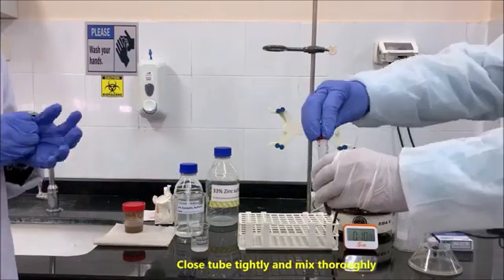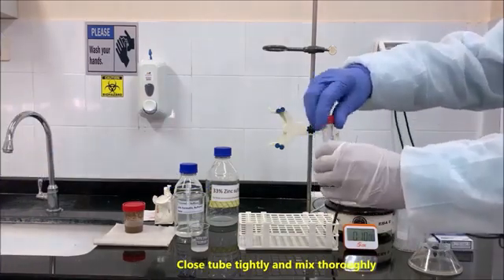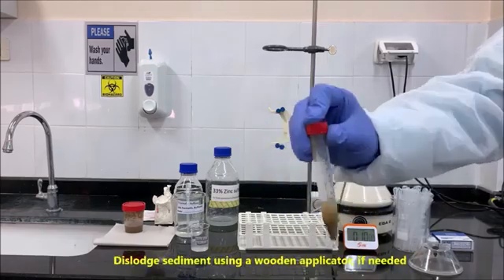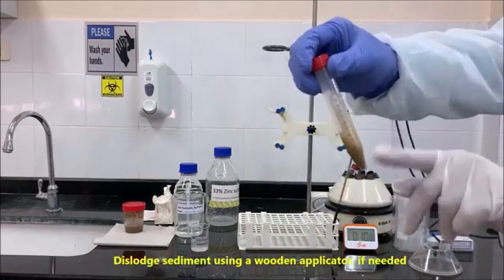Close tube tightly and mix thoroughly. Dislodge sediment using a wooden applicator if needed.